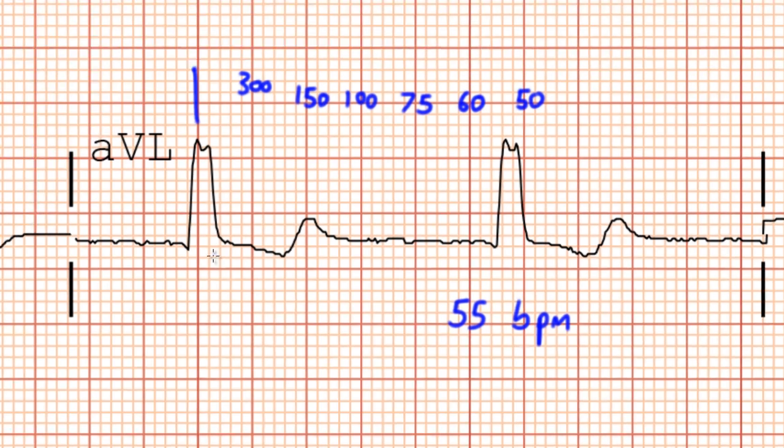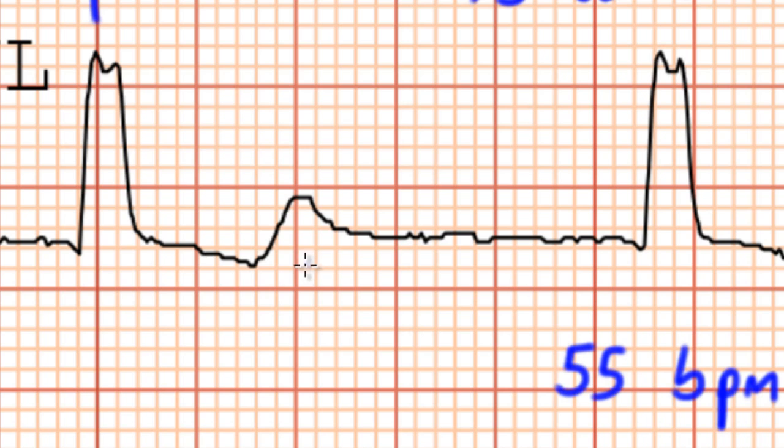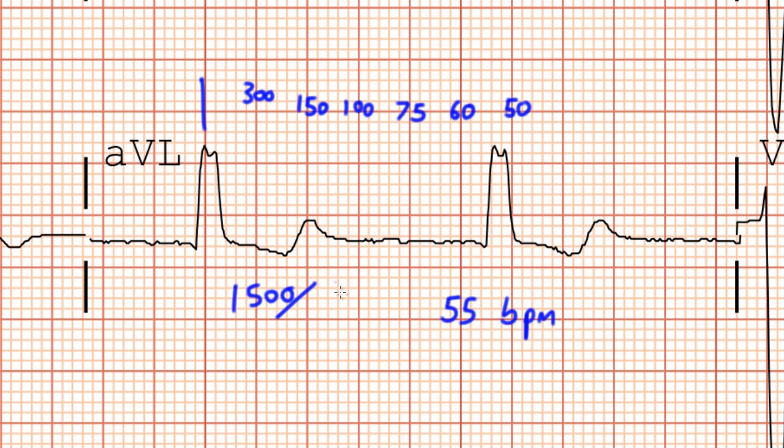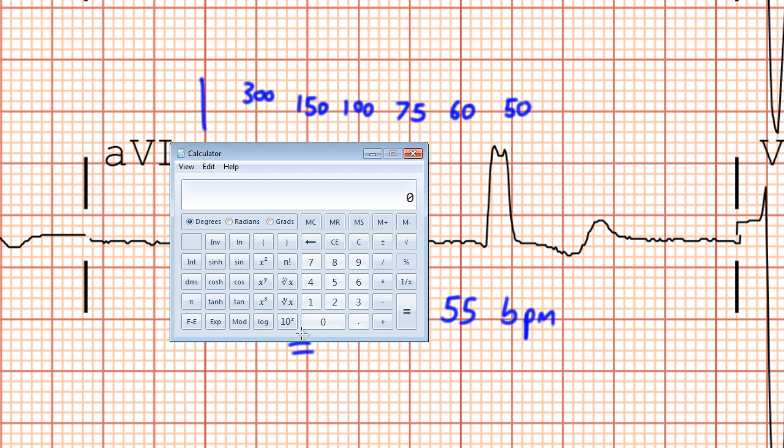Because we're bored, let's just go ahead and try that. 5, 10, 15, 20, 25, 26, 27, 28. We have about 28 small boxes between consecutive QRS complexes. So we can go ahead and take 1500 and divide it by 28, which gives us our heart rate of, does someone have a calculator? Alright, hang on, let me find my calculator. 1500 divided by 28. Okay, so it appears that our heart rate is actually approximately 54 beats per minute. I was close.